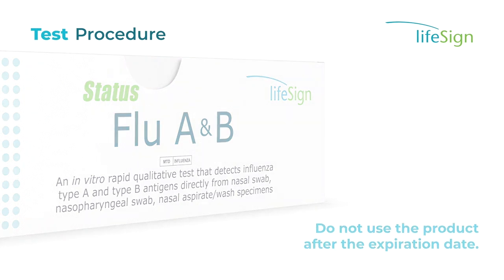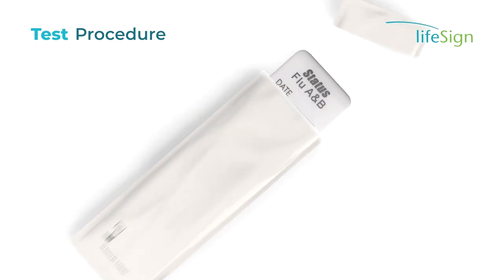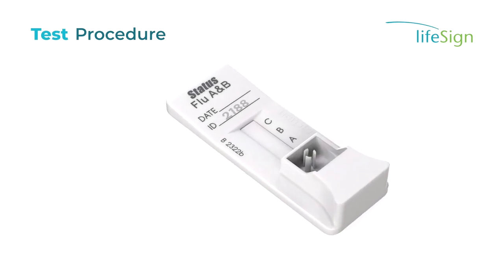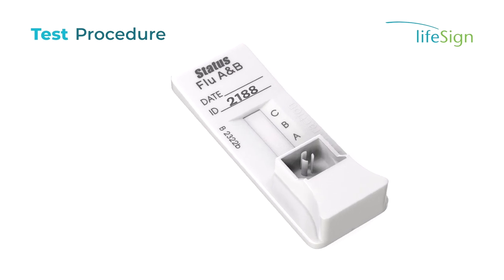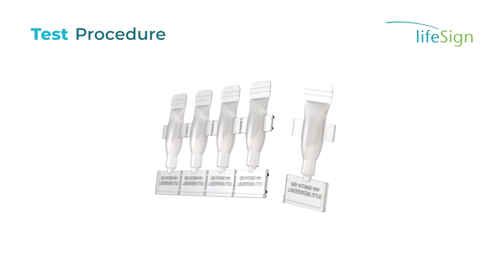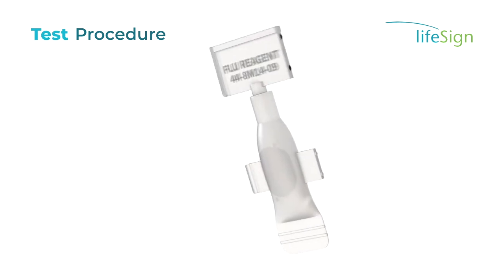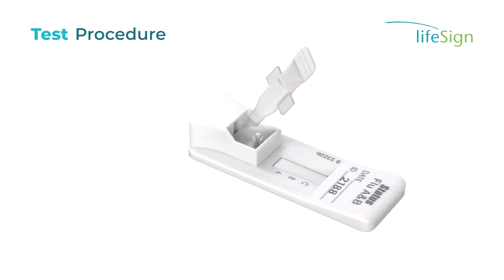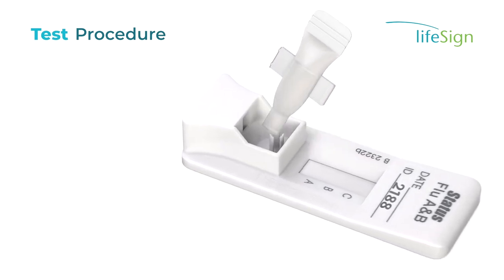Once the patient's swab has been collected, open the foil pouch, place the cassette on a level surface, and label the cassette with the patient identification. Remove 1 extraction reagent capsule from the strip and tear off the tab to open.